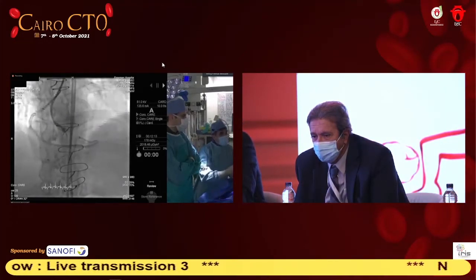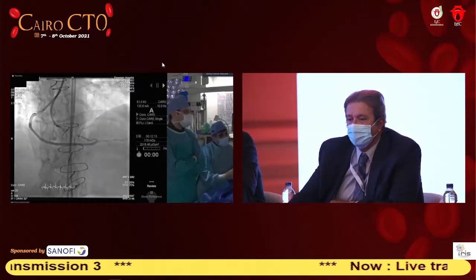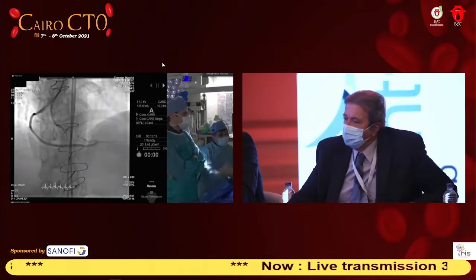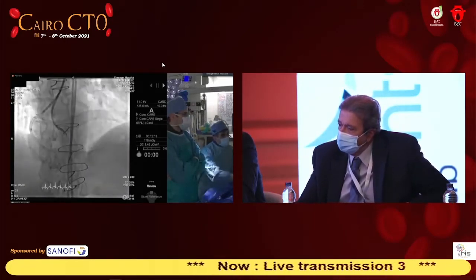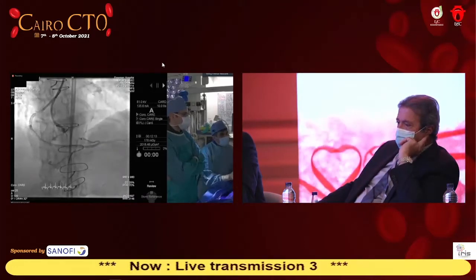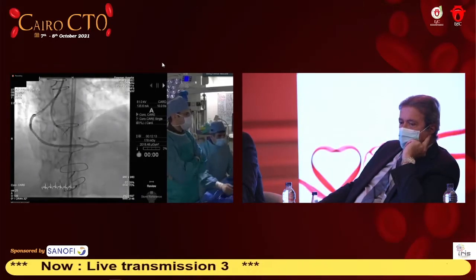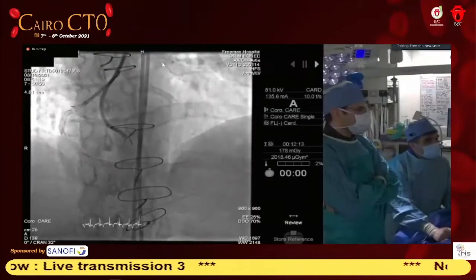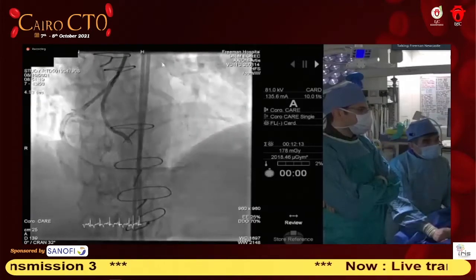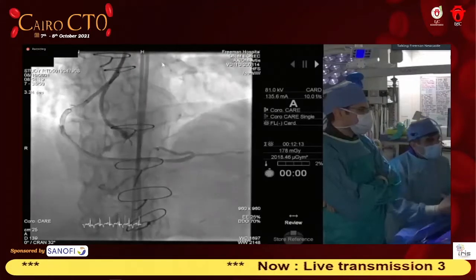It's very open and wide, and you could see the conduit very well, connected very well. And in the same token, you could practice how you handle the equipment, how you manage to deliver the microcatheter and navigate your way through the tortuosity and so on. Then you come to the septals, which are still safe, but could have a problem by dissection or by perforation. Then the epicardials, obviously, which are really for experts and have to be handled very, very carefully, because if you have a problem with them, it could be disastrous.